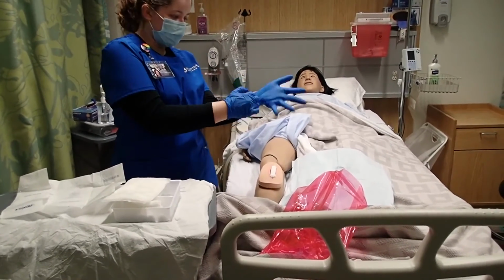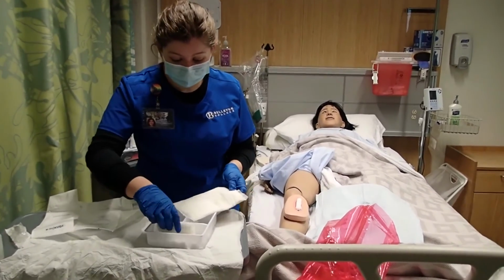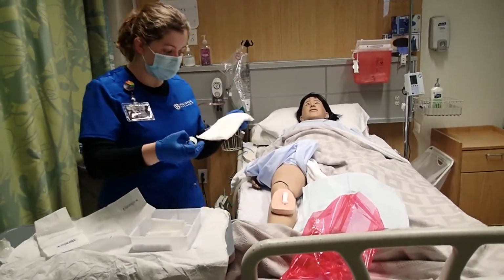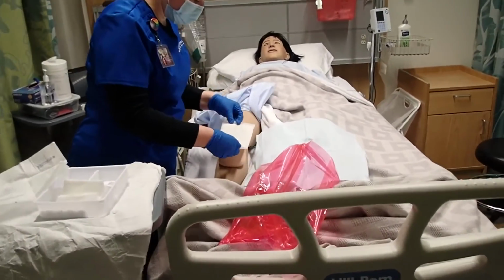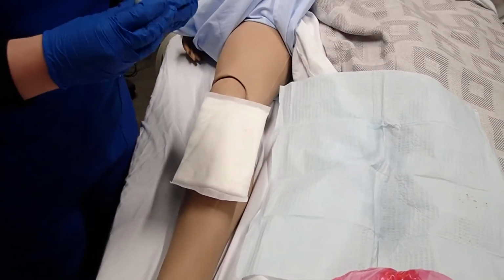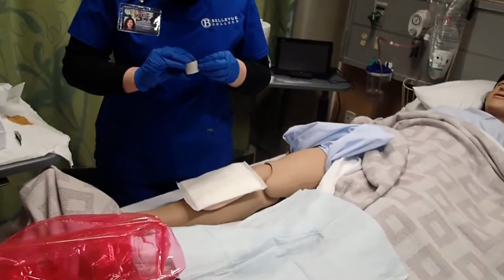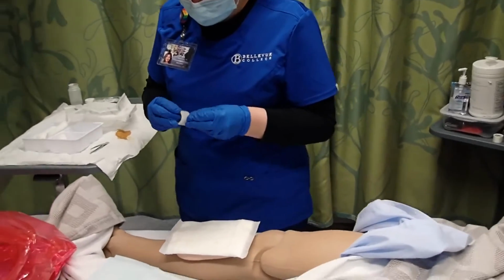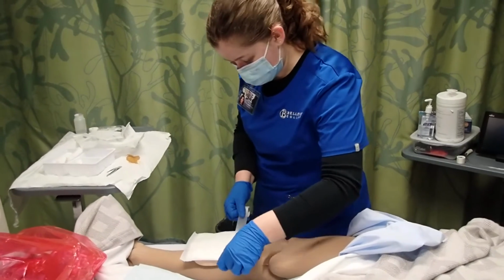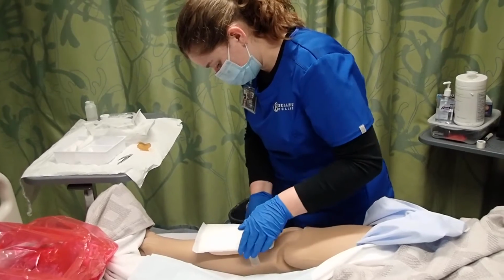Before I entered the room, I did a check in with the patient for comfort, any pain they might be experiencing, checked the doctor's orders and gathered the supplies I need. I take my abdominal pad, place it over the wound. The nurse gently asks your name and date of birth. Perfect. Hello, Mr. Smith. I'm going to be doing a wound dressing. Raise the bed to provide privacy. Gently apply some tape.